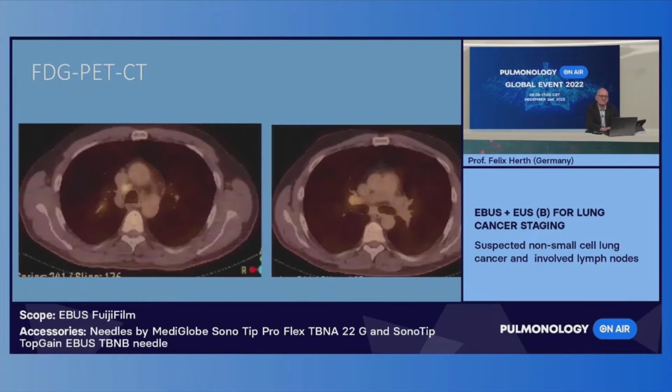On the next slide, we'll see the mediastinal setting. The nodes in the mediastinum are normal, short axis maximum 10 millimeters. Only there is one region where the nodes are slightly enlarged, and this is in the region 4R, paratracheal to the right. The short axis is around 12 millimeters on the CT scan, and you might appreciate that there is FDG uptake in the node. And on the other image, you see some slight uptake in the hilar as well.